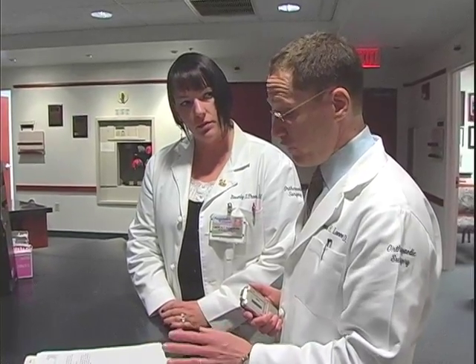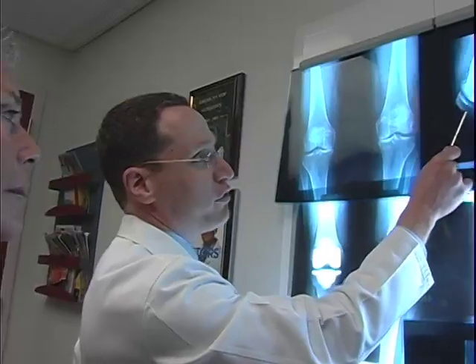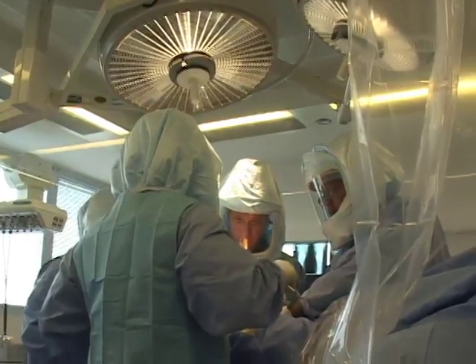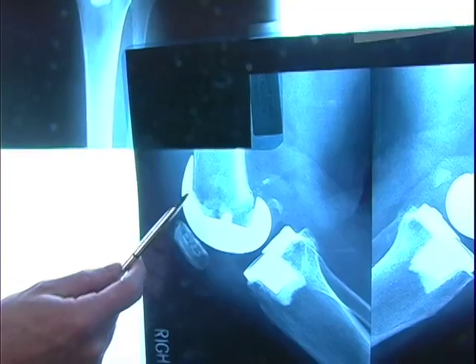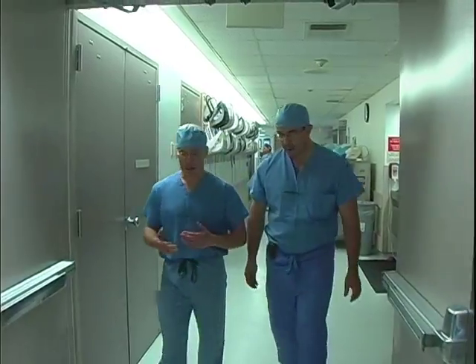There's been an evolution of our approach to knee replacement surgery. The technique has been modified over the years, the instrumentation has been changed, the implants have been modified a bit, and the natural transition has been to shorten our incisions and allow a less invasive approach to total knee and partial knee replacement surgery. Minimally invasive techniques for knee replacement surgery have been available since 2003. As an early adopter, I have spent the last few years honing my skills and modifying the techniques to better suit our patients in refining the techniques in the care of knee surgery.